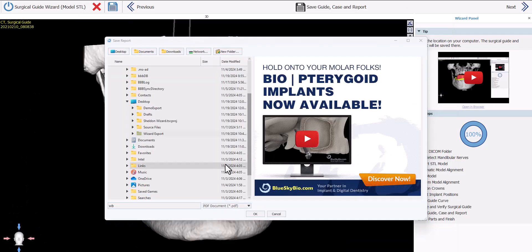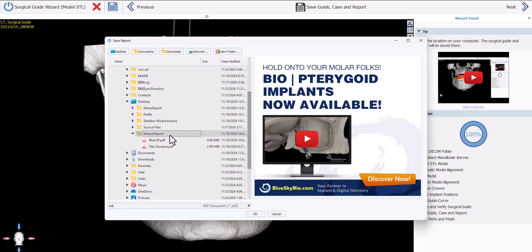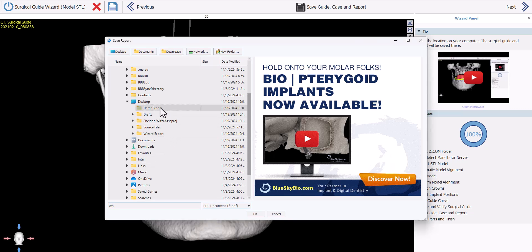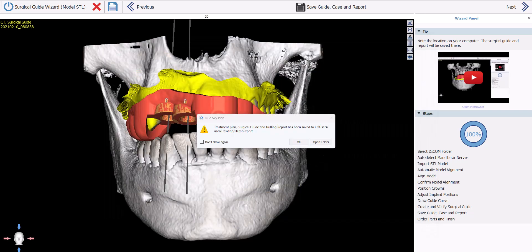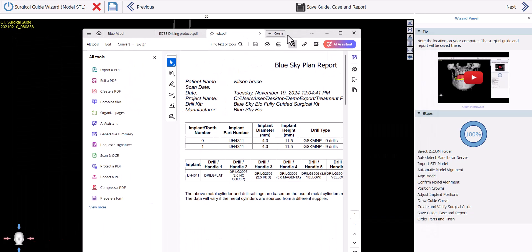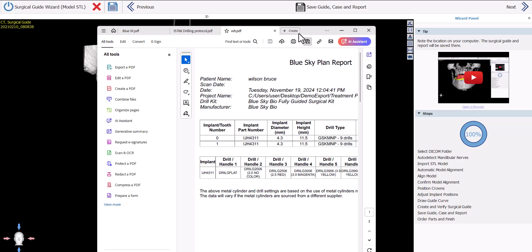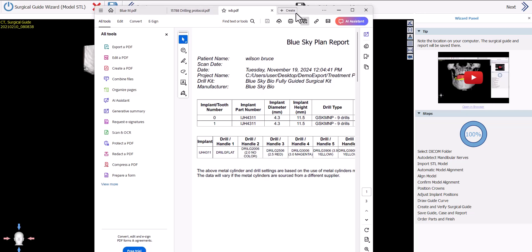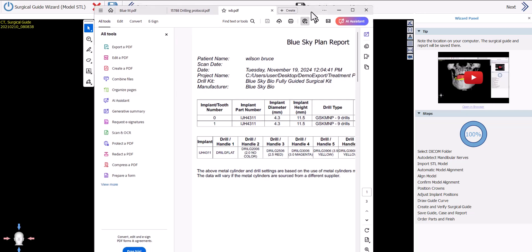The software is asking where the PDF drilling report should be saved. Select the same folder as previously used and click OK. The drilling report will be saved to the relevant location and will open on screen as well.